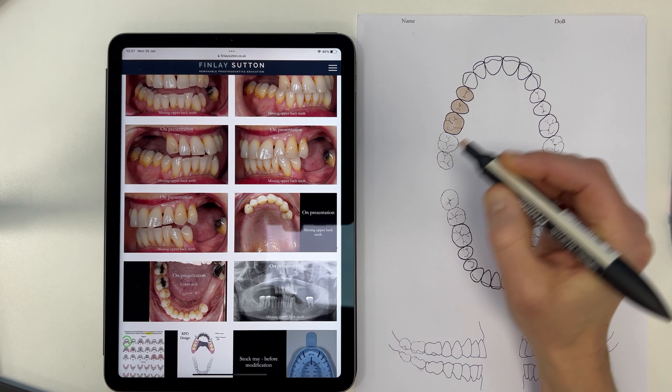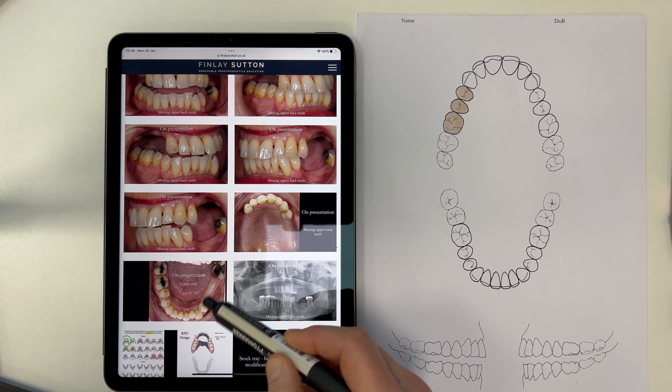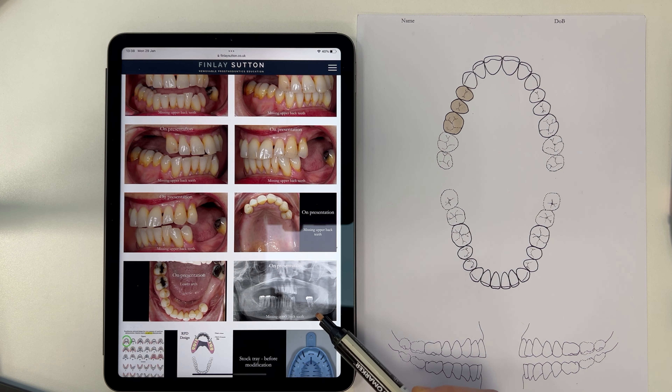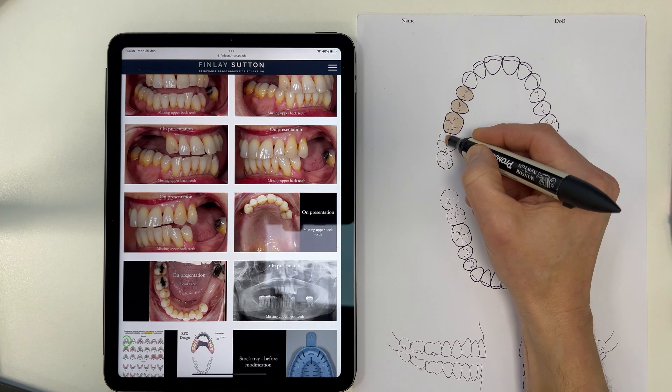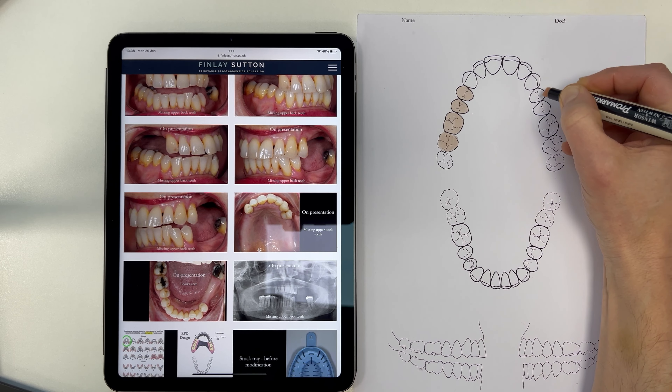She's got a full arch of lower teeth. She's got this gap just there but that's right at the back, so this is going to be biting onto the seven. I'm just going to cover in those on both sides just like this.